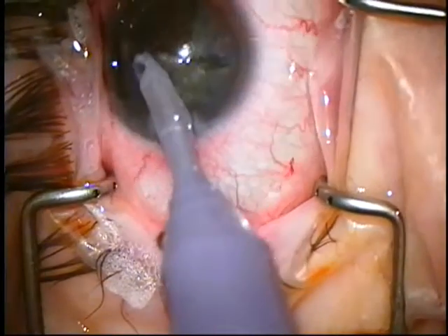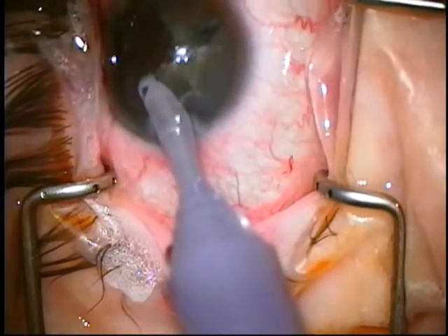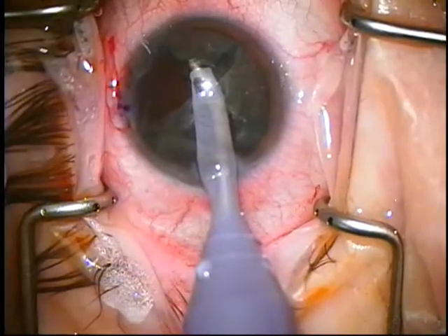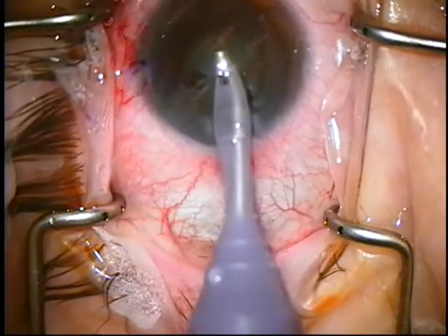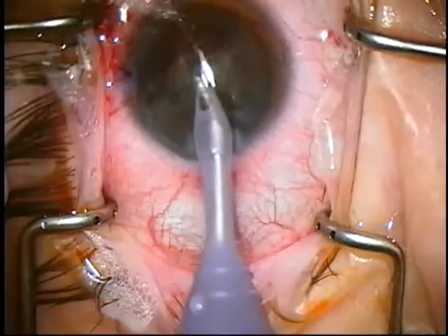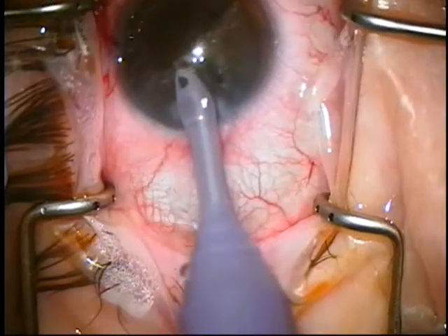I can turn with this or my chopper. Same thing — in the wall, and slowly pull. It's very methodical, nothing too fast. I'm only on second position when I'm pulling.